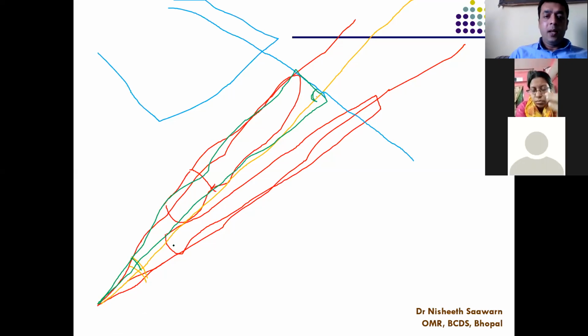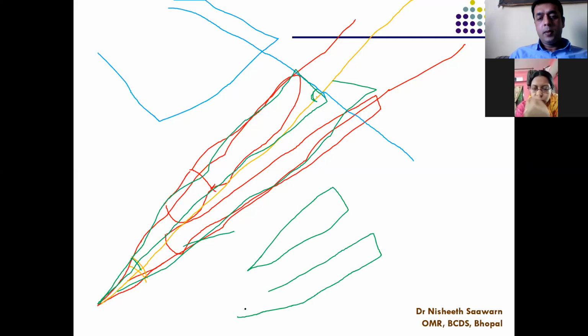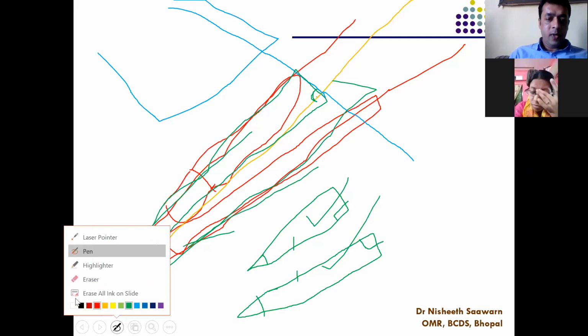So this angle and this angle, and we have another triangle on this side. We ended up with two triangles, one like this and one like this. This imaginary bisector is common. The larger angle was bisected into two angles, so these two are equal to each other, and this was falling at 90 degrees, so these two angles are 90 degrees to each other. So this triangle will become equal to this triangle. That's why the size of the tooth and the image of the tooth on the film will remain the same. I'll try to explain again, then you all will understand.